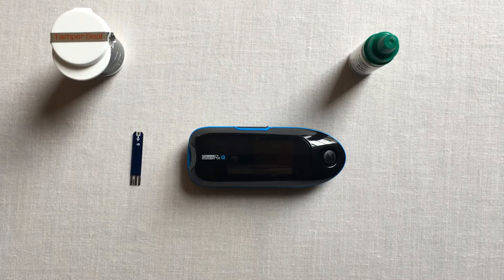Welcome to the demo video for our GlucoRx Q-meter. Here we will be covering how to perform a quality control test. Our GlucoRx control solution contains a known amount of glucose that reacts with the test strips, and it is used to ensure the meter and strips are working together correctly.